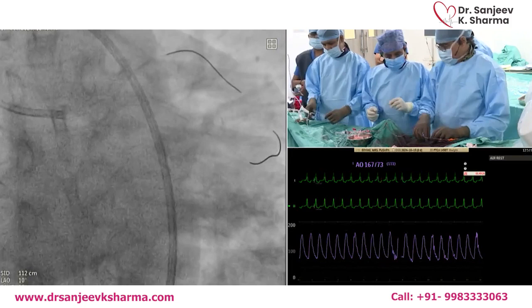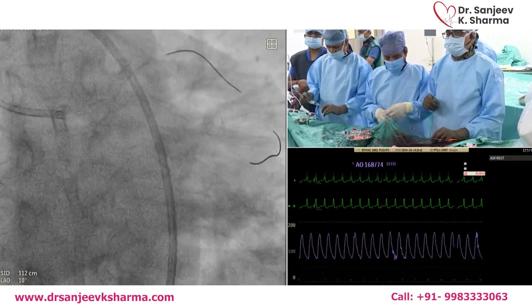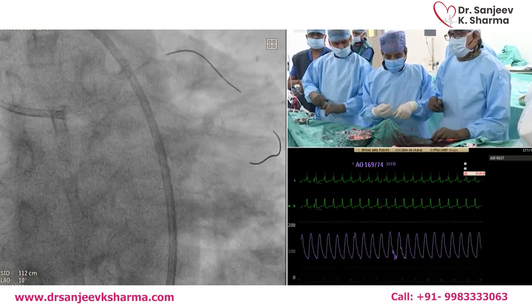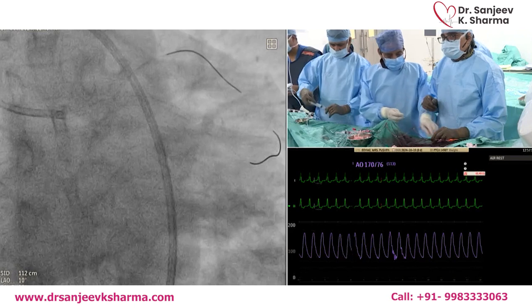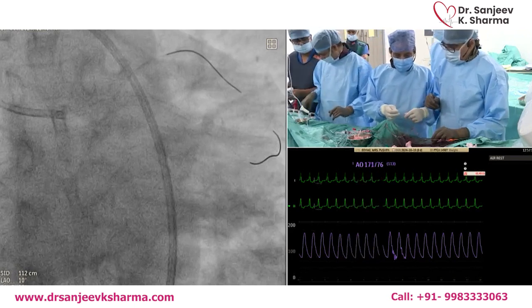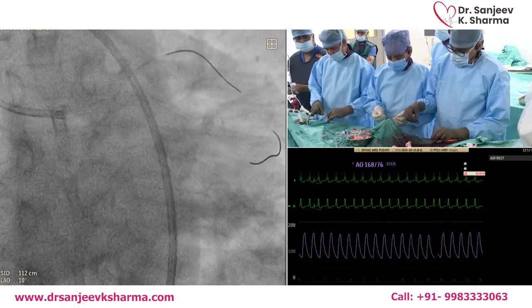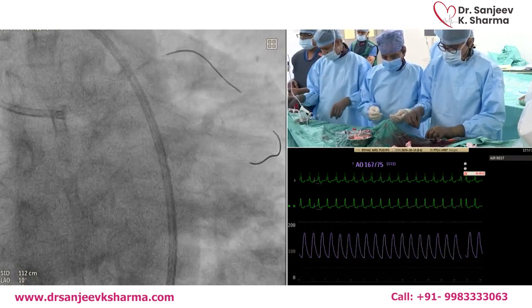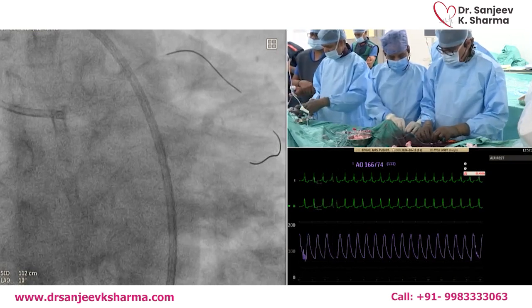Okay, so when you were positioning the left LAD stent, I always get worried about missing the ostium of the left main, and I usually look at an LAO view, because you wanted to go right up to the ostium, right? Yes. So you like to check the ostium of the left main in LAO cranial to see that you've not missed the ostium. So very good point.